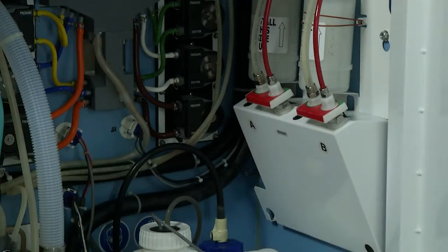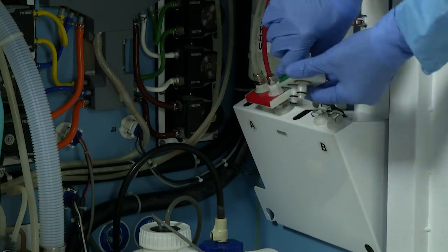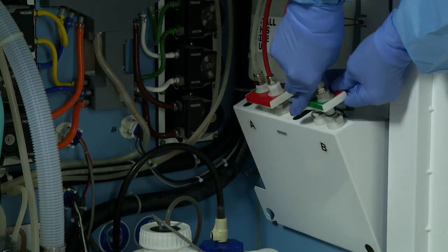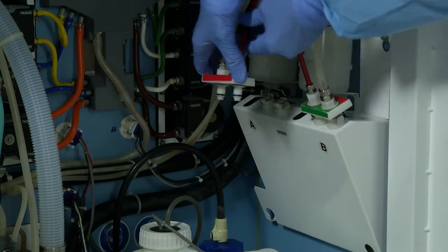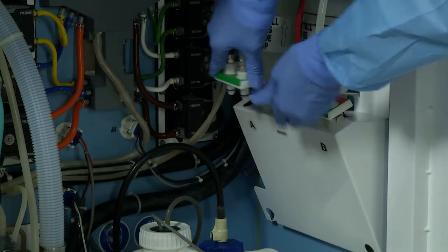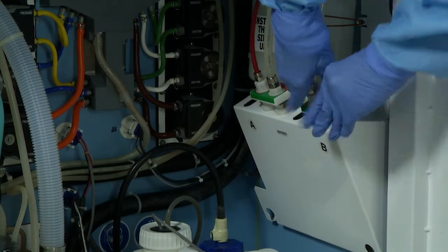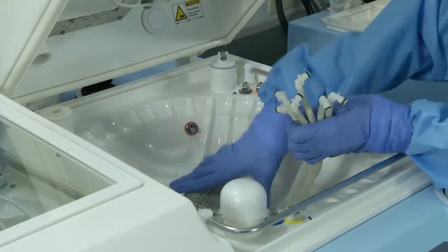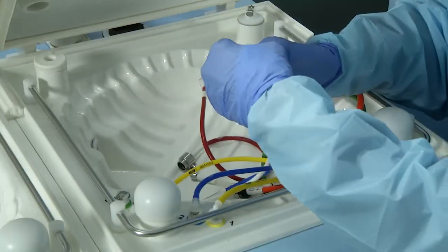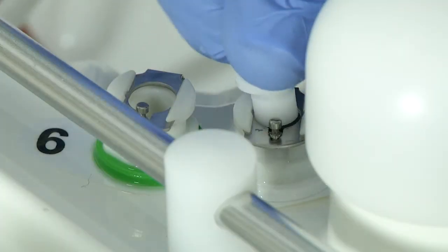When the self-disinfect cycle is complete, turn the quick disconnect fittings 180 degrees back to the setting with a green portion of the label facing left. Check closely that both fittings have been snapped into place properly. There will be two noticeable clicks on each fitting when properly seated. Remove the clear connectors and store until the next use. Then, reattach the color connectors so that the system will be ready to run the next reprocessing cycle.